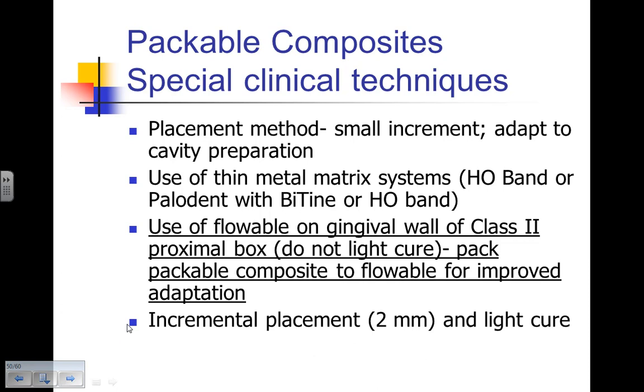We place an increment no greater than 2 millimeters, light curing for 20 to 30 seconds for each increment. The darker the composite, the greater the light cure. Packable composites tend to be more opaque than our conventional nanohybrids.